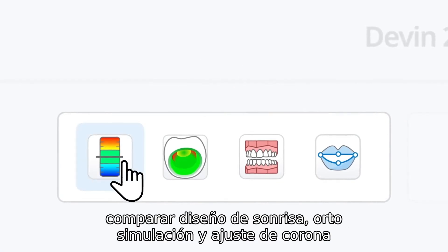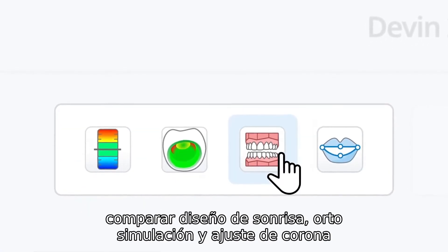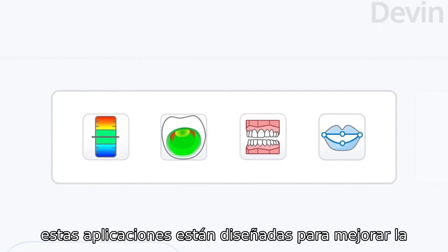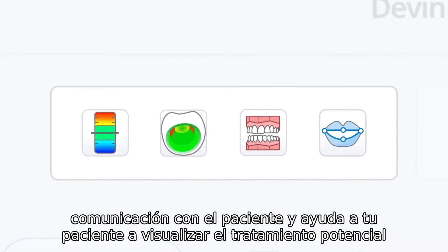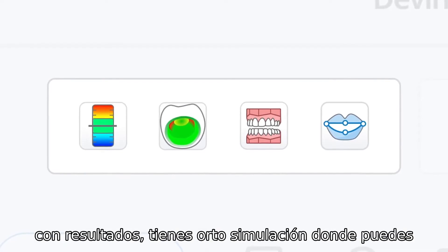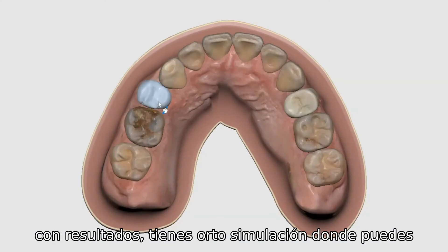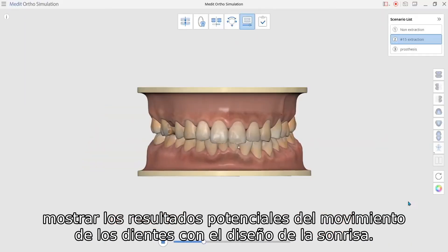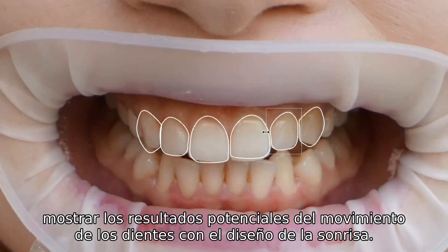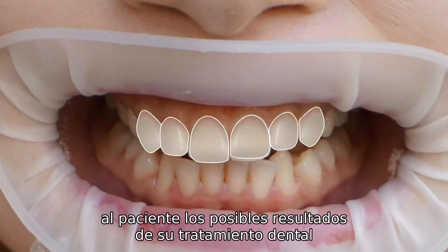We have MediCompare, SmileDesign, OrthoSimulation, and CrownFit. These apps are designed to improve patient communication and help your patient visualize potential treatment outcomes. With OrthoSimulation you can show potential results of tooth movement, and with SmileDesign you can show the patient the potential results of their dental treatment.